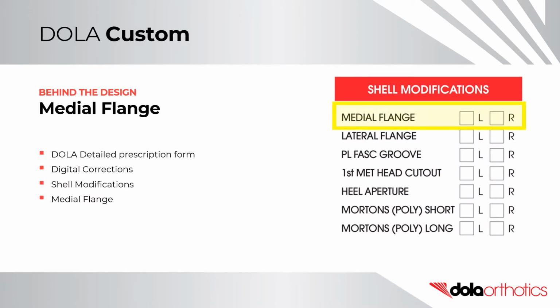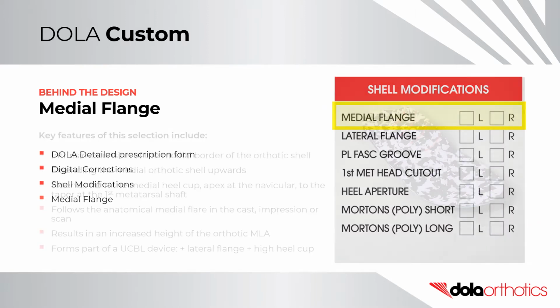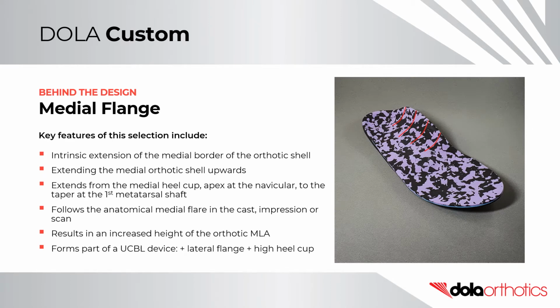They selected a medial flange from the shell modifications section within digital corrections on the DOLA detailed prescription form. Key features of this selection include an extension of the height of the medial border of the orthotic, extending the medial longitudinal arch upwards. The flange extends from the medial heel cup with an apex at the navicular to taper at the first metatarsal shaft.